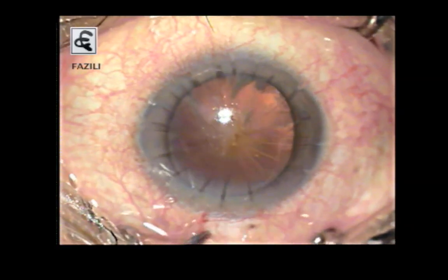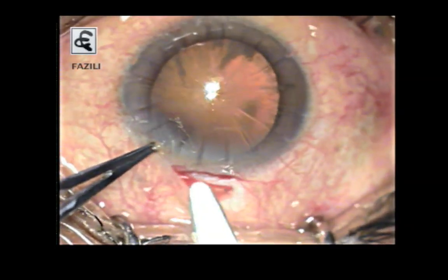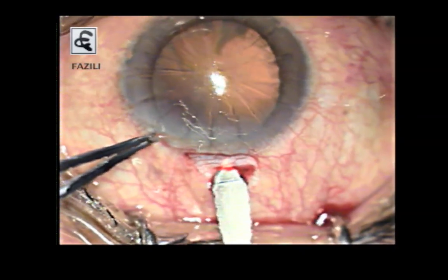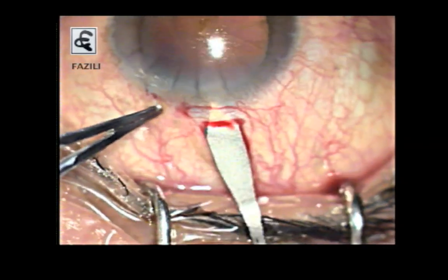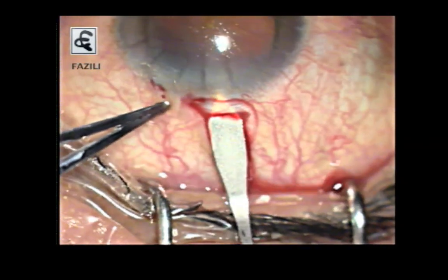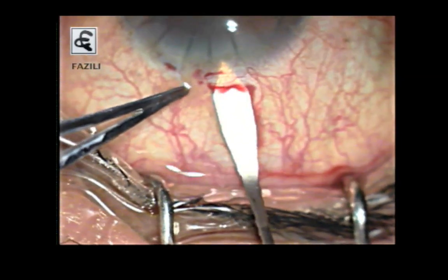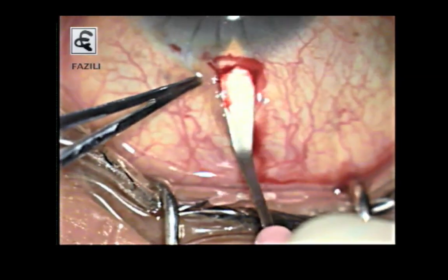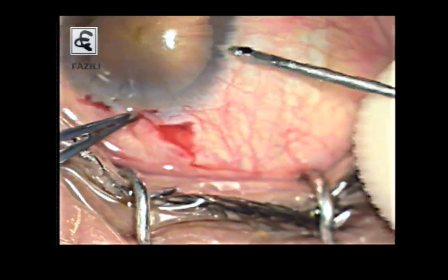So another thing which we are confronting nowadays is those people who had a radial keratotomy done when it was quite popular are now developing cataracts. Here you can see I've chosen not a corneal incision, not a limbal incision, but a scleral incision. So obviously the scleral incision is much safer in these cases.